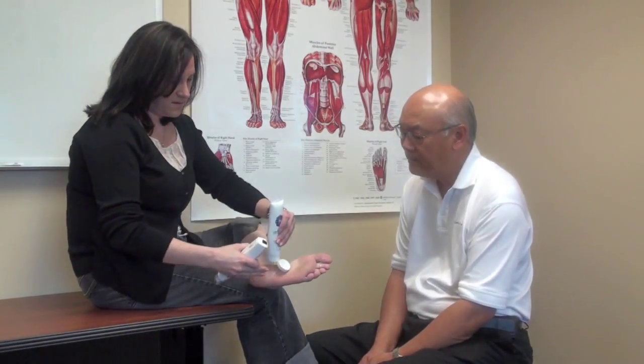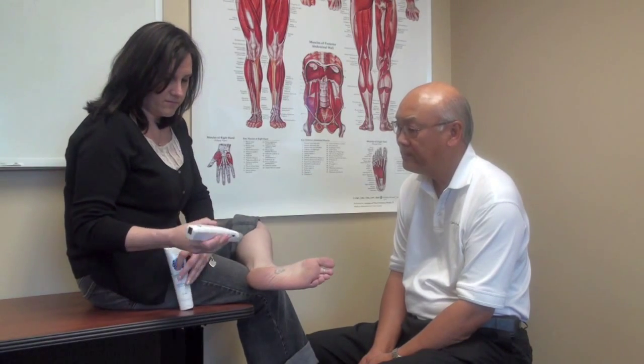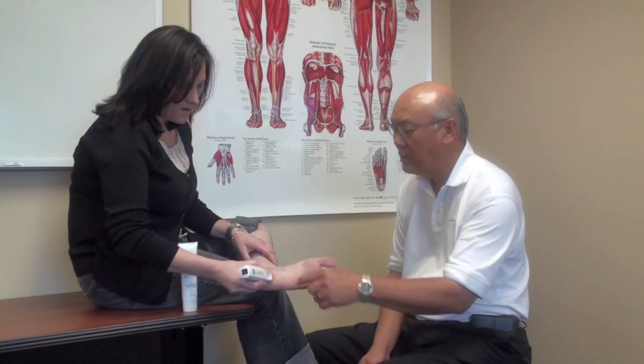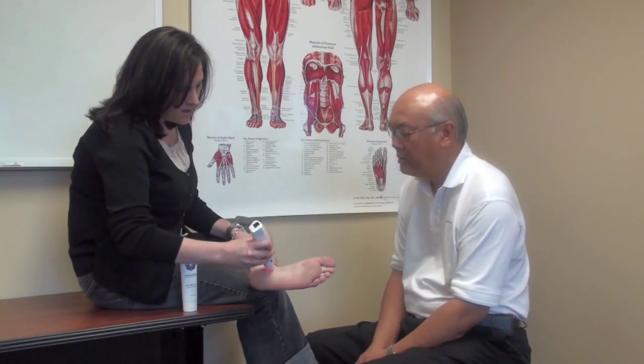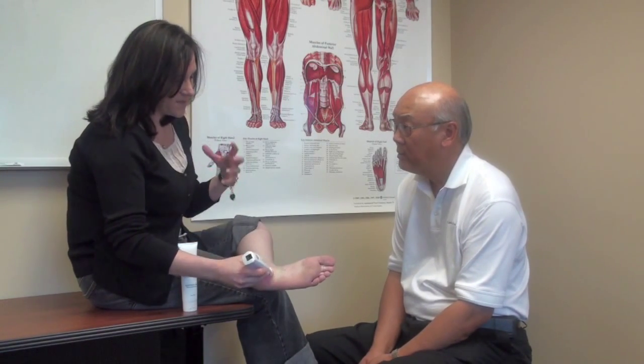The morning when I wake up is when it bothers me most. Can you show me how you've been treating? I keep the electrical stimulation dial pretty much down low because it gets very sensitive.